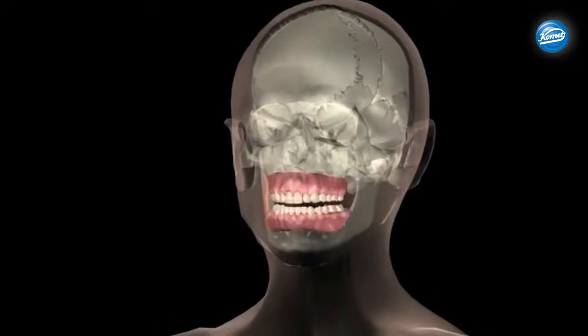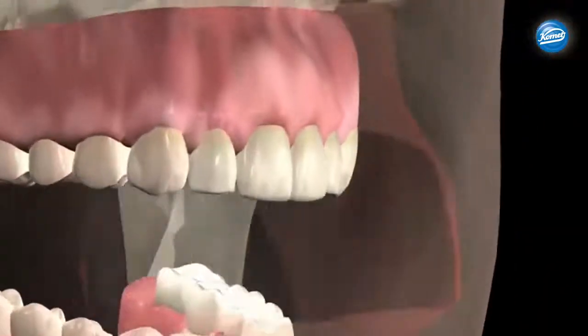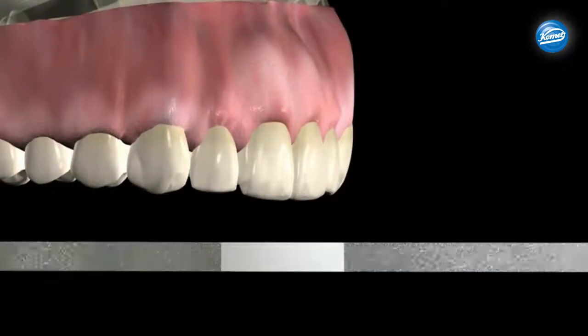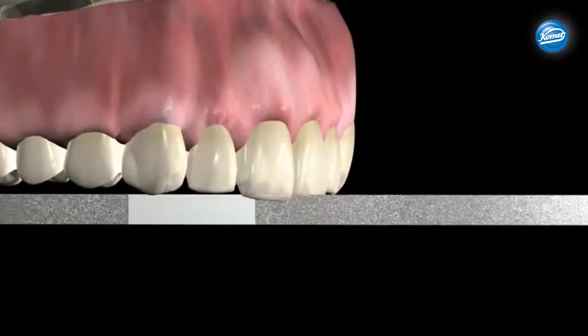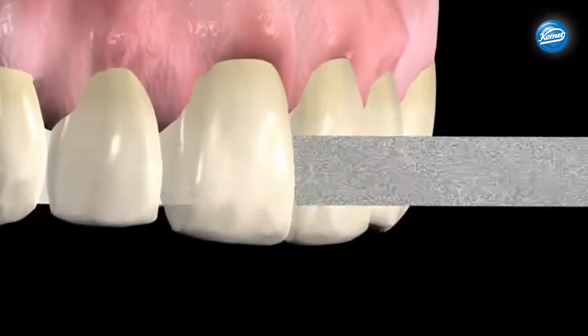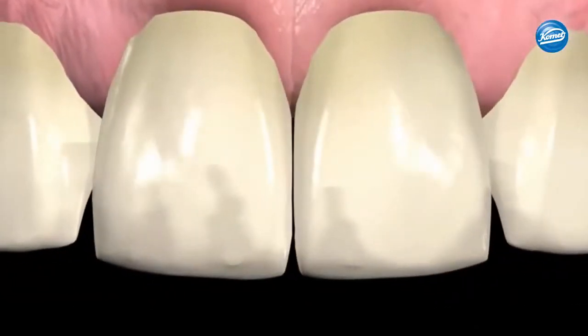The innovative OS system was designed for safe interproximal enamel reduction and doesn't require the use of a disc guard. Insert the diamond strip using gentle manual separation into the non-cutting area. A fine and medium strip might be necessary.